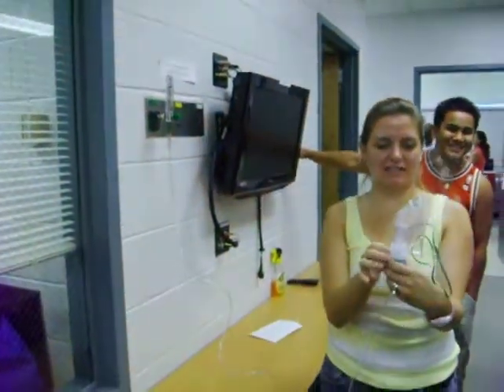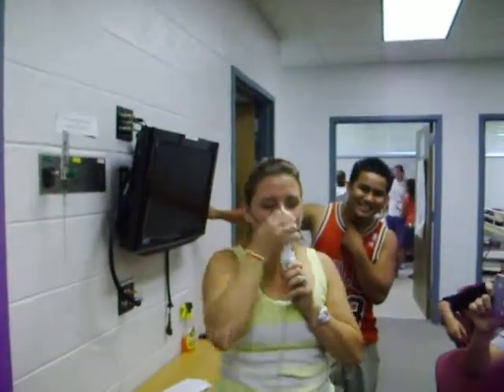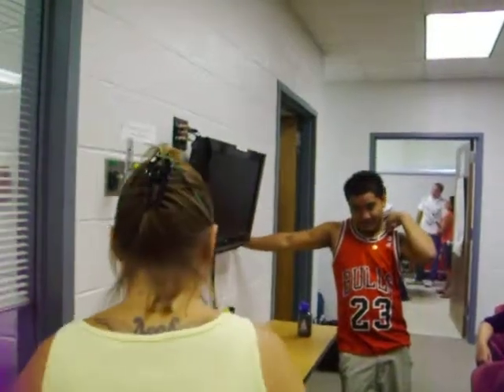Put your mask on and go ahead. Just sit down in case you feel lightheaded or dizzy, and take your treatment. What we're doing now is watching her take the treatment. You notice how it makes quite a mist? You notice how the person breathes and you can see the fog appear and disappear? You're supposed to breathe through your mouth — you get more medicine that way. Your nose filters particles; it will filter out the medicine. You will get less medicine if you're breathing through your nose.